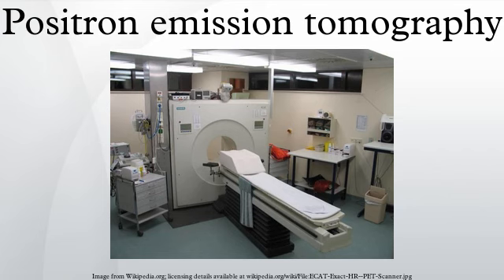As the radioisotope undergoes positron emission decay, it emits a positron, an antiparticle of the electron with opposite charge. The emitted positron travels in tissue for a short distance, during which time it loses kinetic energy, until it decelerates to a point where it can interact with an electron. The encounter annihilates both electron and positron, producing a pair of annihilation photons moving in approximately opposite directions.